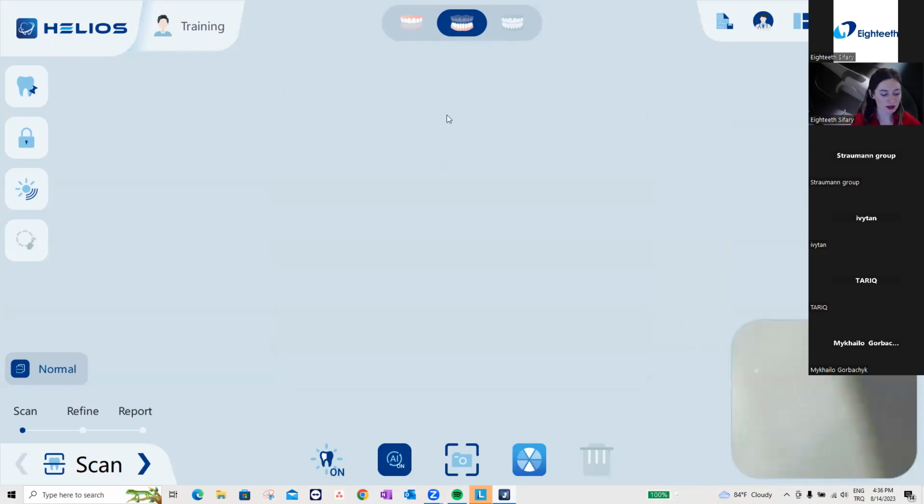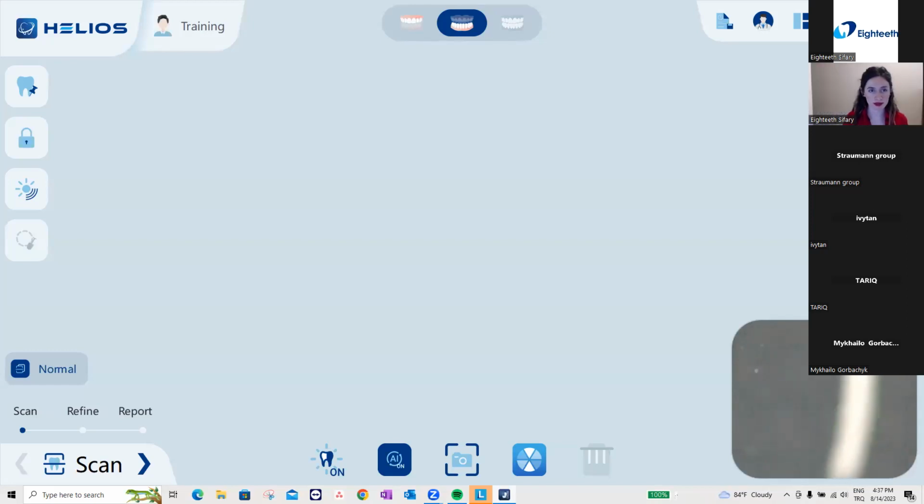So I'm going to take my scanner, but let me first remove my background. It would be better. Okay, and I'm going to adjust. I'm just going to take it down to my camera, and you will be able to see better during my scanning.